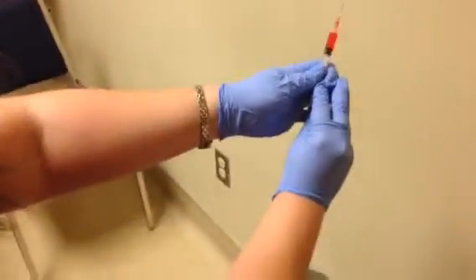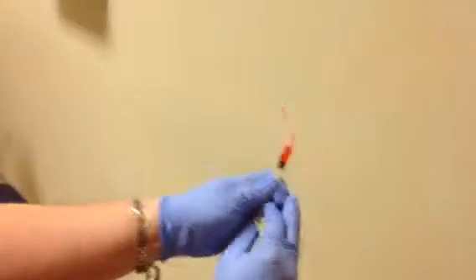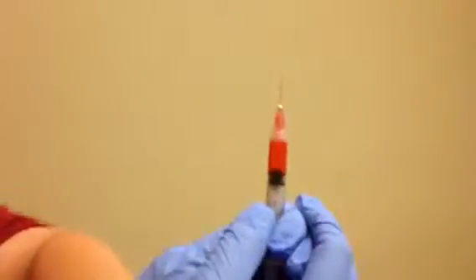I would hold this over the trash can. Now again, if it's a narcotic, you got to be careful. You wouldn't want to just do this without somebody watching you. Okay? Alright. So I've got 1 milliliter of medication.